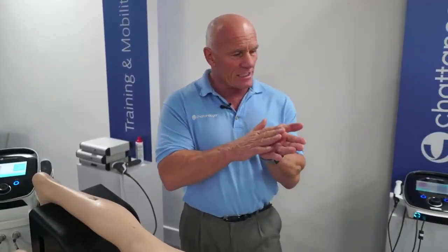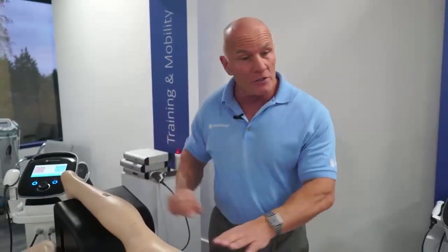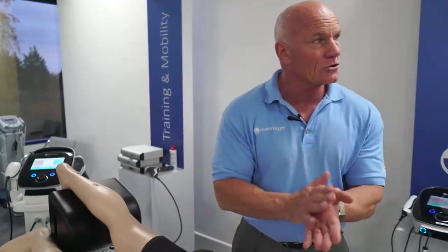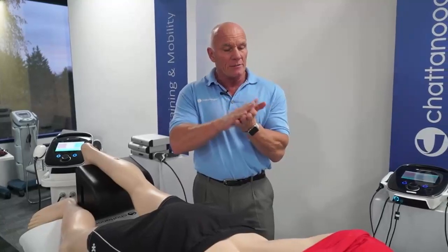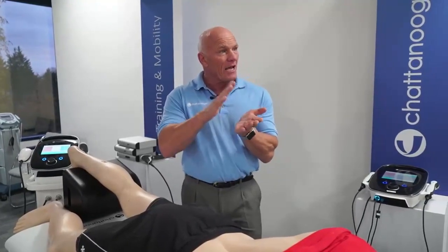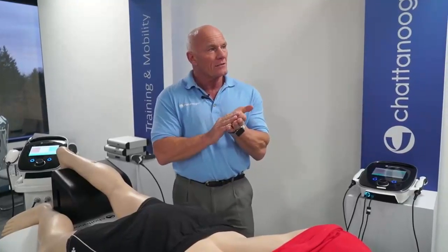And gradually, during the treatment, it's going to gradually increase the pressure automatically. I haven't got to touch the machine. I can concentrate on my patient. And because we're building it up slowly, the patient can accommodate to it. And this is then how we get to those maximum tolerable intensities.